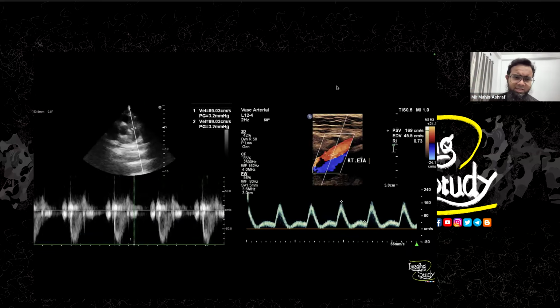So let me show the pictures. This is the continuous wave Doppler. We commonly use it for echocardiography because we need high velocity flow detection. But for the peripheral arterial Doppler study, we need more information. For that reason, we need to know the systole and diastole and in between them. So you use the pulse wave Doppler for the peripheral and all the abdominal and obstetric Doppler ultrasounds.